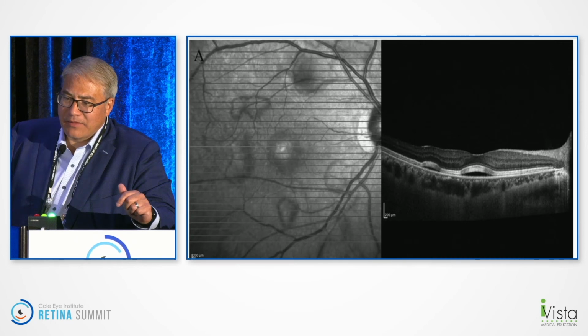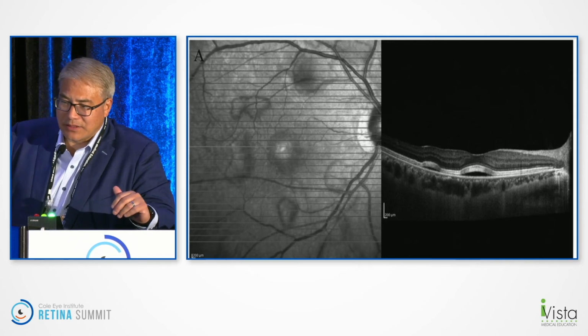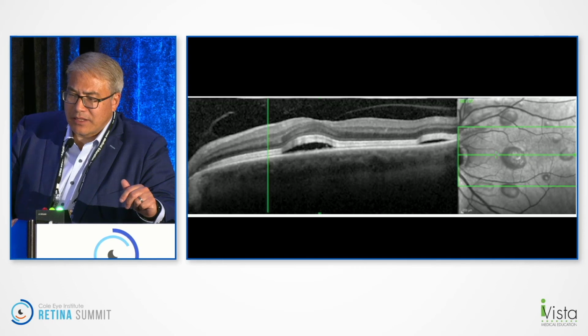How about this? Mechanism. What medication are they on? MEK inhibitor, exactly. Usually bilateral, oftentimes bilateral, CSR, VKH type of appearance. Dose dependent, so increased fluid depending on the dose. Here's the other eye.